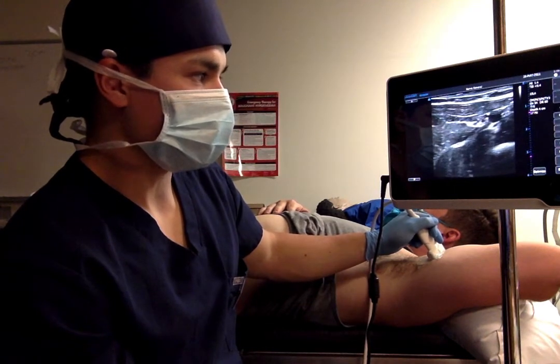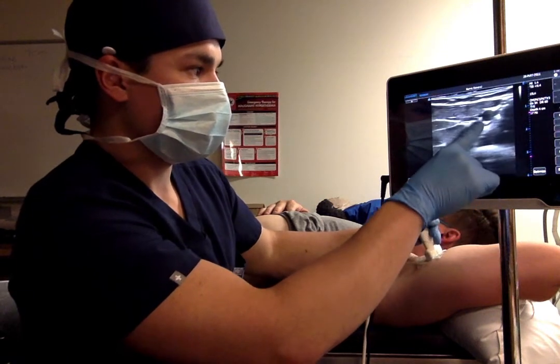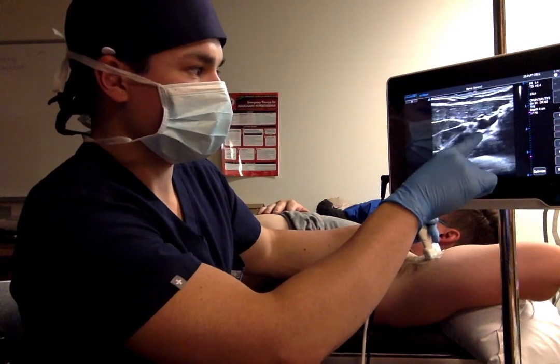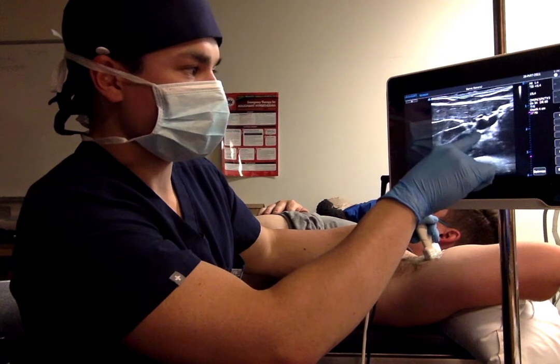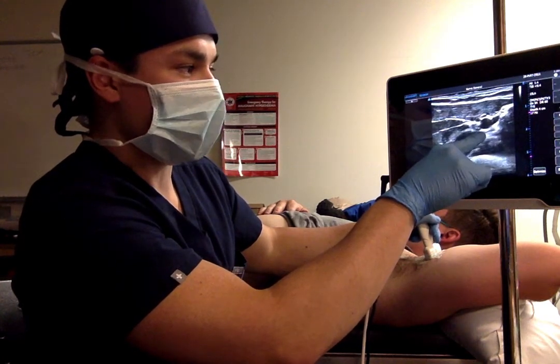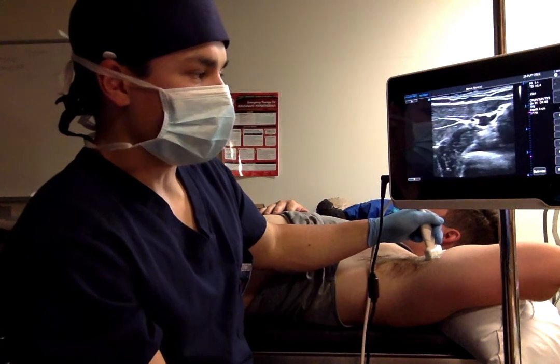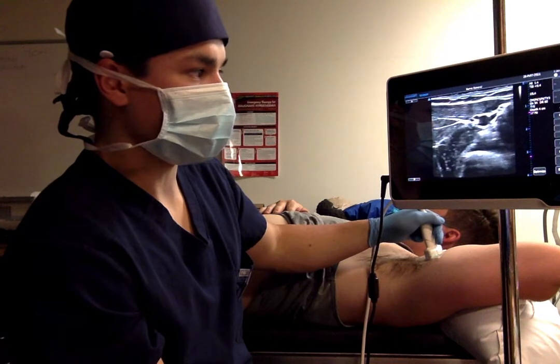Then we'll withdraw the needle and redirect that towards below the axillary artery, avoiding those vessels, aspirating, and we can use our peripheral nerve stimulator again and elicit at 0.3 to 0.5 as our goal some finger twitches.